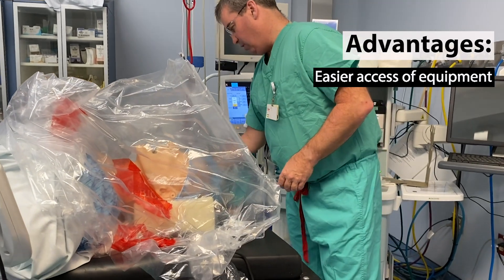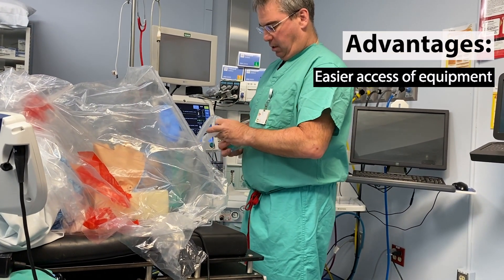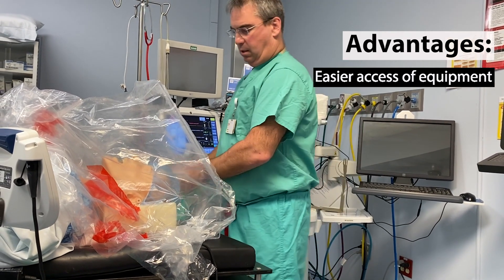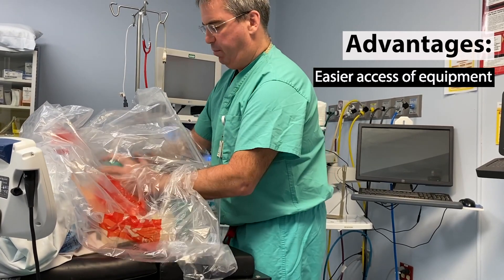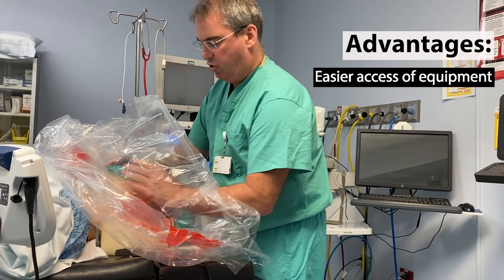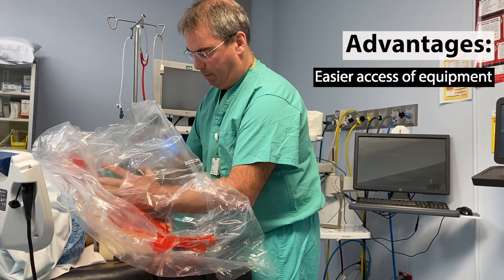So from the standpoint of the anesthesia provider, a standard circuit can come in to the side with PPE, and we can adequately pre-oxygenate. Then you can have another person just keep the tent around your arms so that no droplets are coming around.